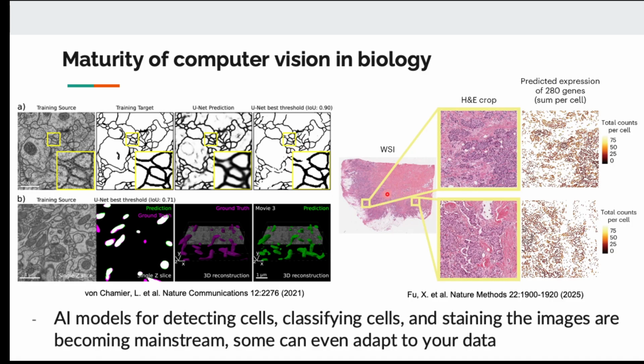And this is the example that I mentioned where in real life, we want to understand the cell type or understand the protein expression inside the image. If you want to do that as an experimental biologist, you have to stain the protein to image it. But nowadays, people are working on models that can look at unstained images, like H&E images, which aren't stained for any protein.